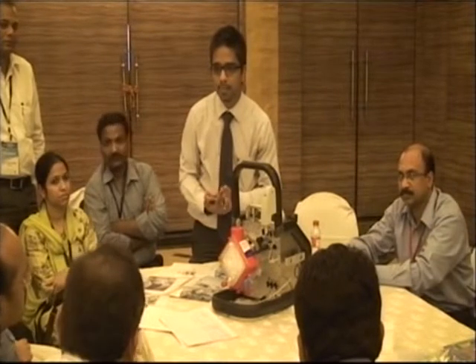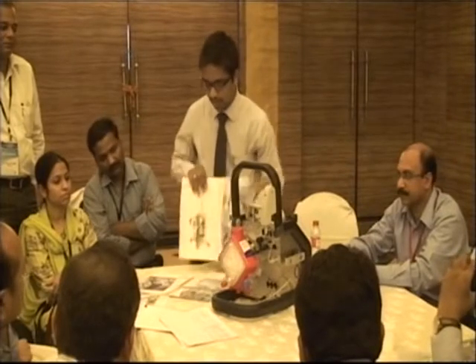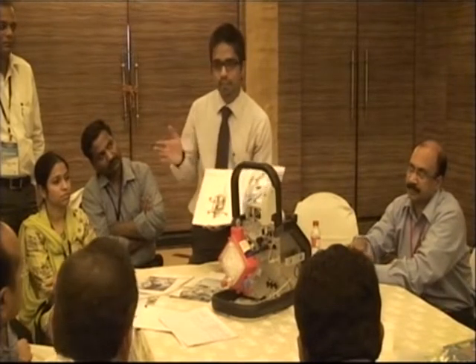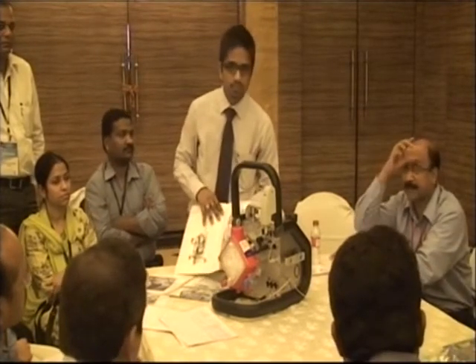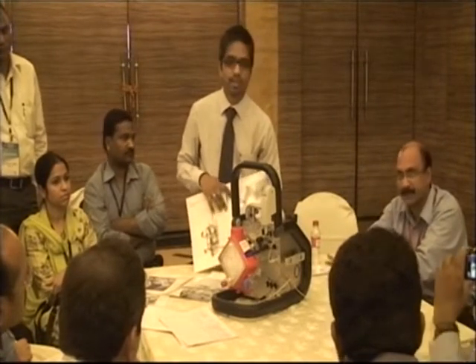What is basically the gas source? What kind of gas source do you need? We need a special air oxygen blender, which is a part of this whole equipment. So we need to have proper control of oxygen and compressed air. You must be having those gas blenders for fixed ventilators. Yes, the same thing can be used.